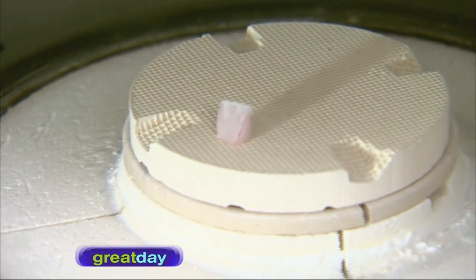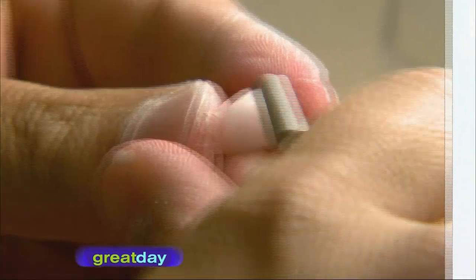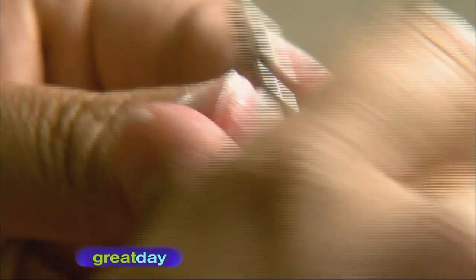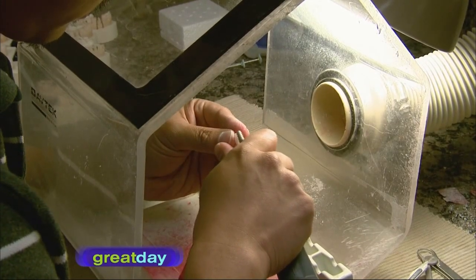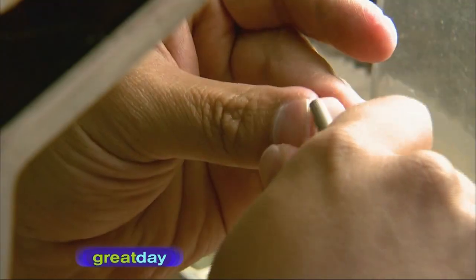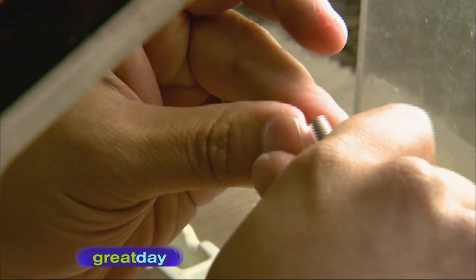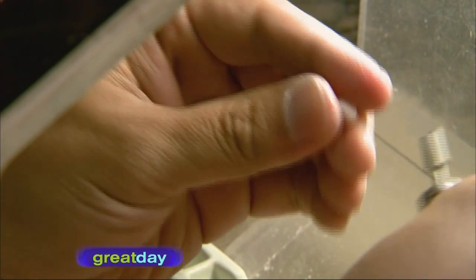After the porcelain layers are built up, they are fired in the furnace. After firing, a burr is used to grind the porcelain into exactly the correct shape so that the sides are in line with the adjacent teeth. They also grind in detail to match other teeth and make sure the crown is in the correct position.